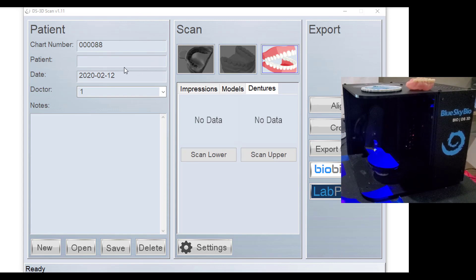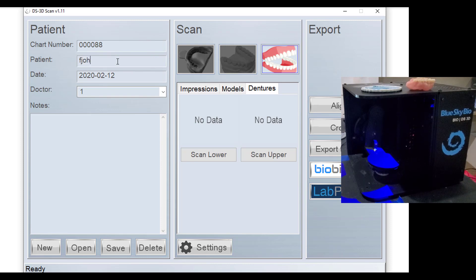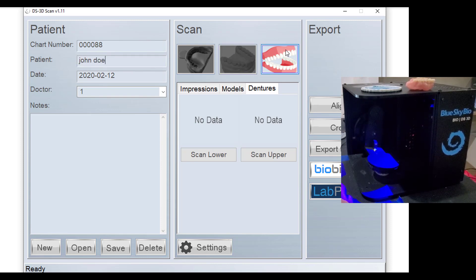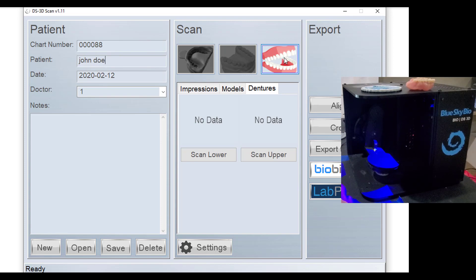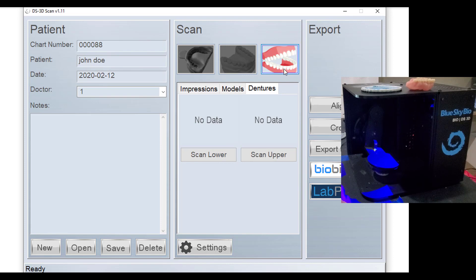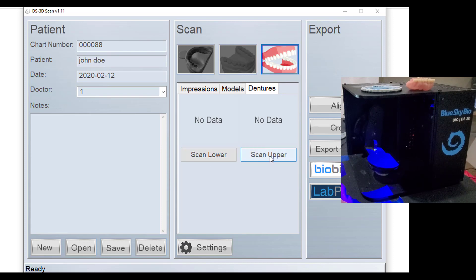You're going to open the DS3D software, type in your patient's name, and you're going to see a new icon up here in the upper right. This is the denture scanning workflow, and once you click on that, you see that there's an option to scan lower or scan upper.